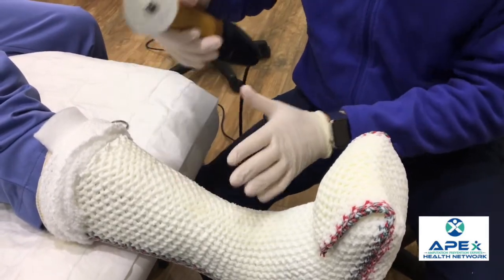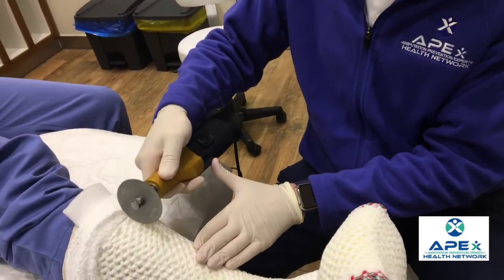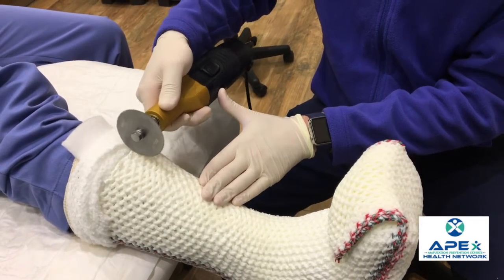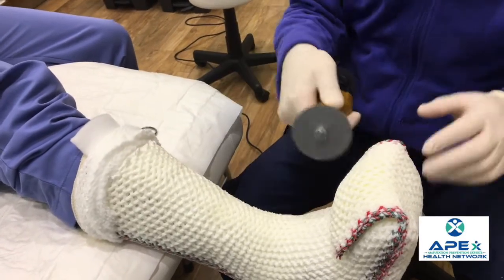When you cut, I like to have one hand on the saw and the other hand stabilizing myself along the cast. Then I'll make the cut here first on the edge, go all the way through the cast, and once you're through, you can just rock this back and forth all the way down the cast until you get to the end.